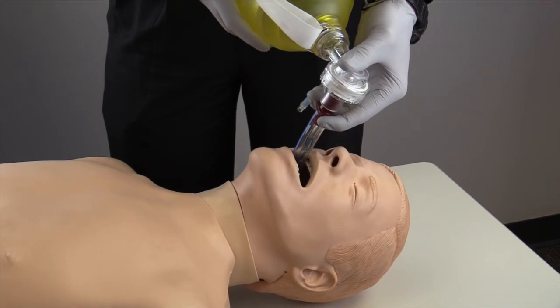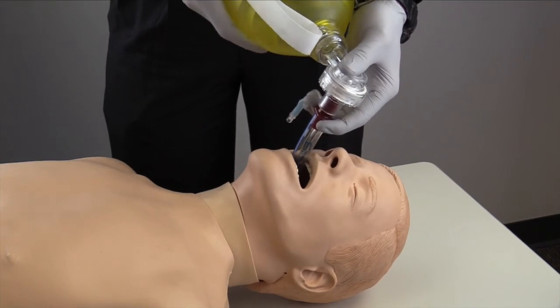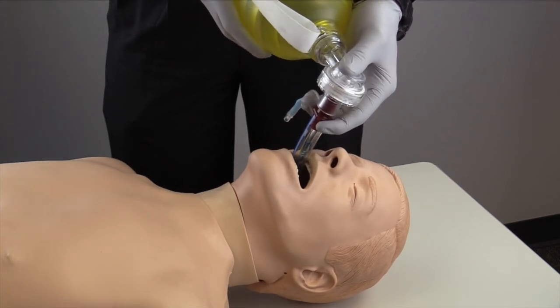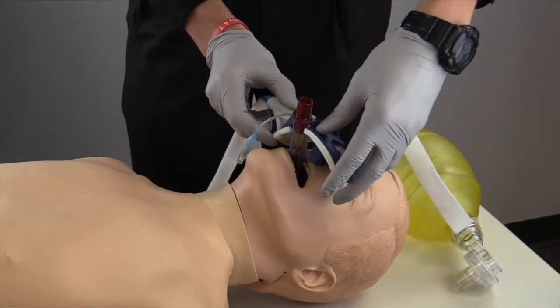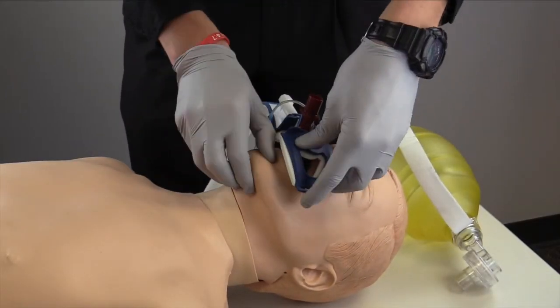I will confirm tube placement by auscultation, listening for the absence of gastric sounds and presence of bilateral lung sounds. Ventilations will now be at a rate of one breath every six seconds. After confirming placement of the tube, I will secure the tube and continue providing care for the patient.